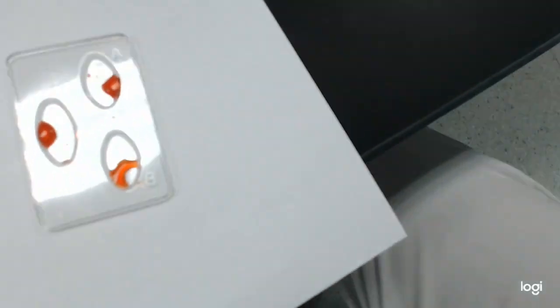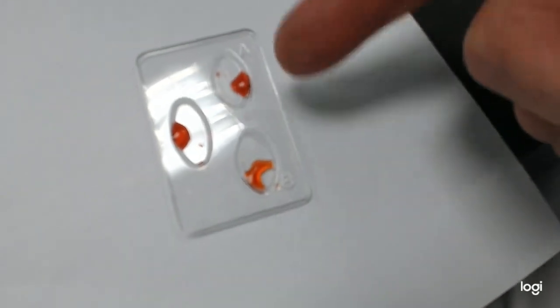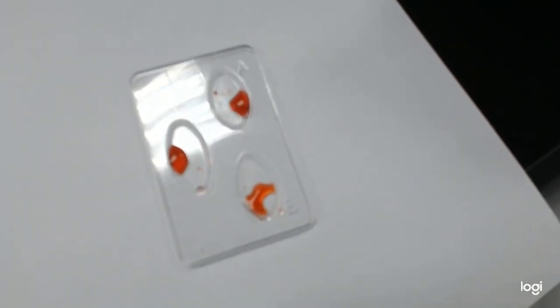Okay, well, let's make a decision here. First of all, let's say that none of them clotted. What type of blood would this be? Well, it would be O negative because it has no A or B and it has no RH. So that would be O negative blood.